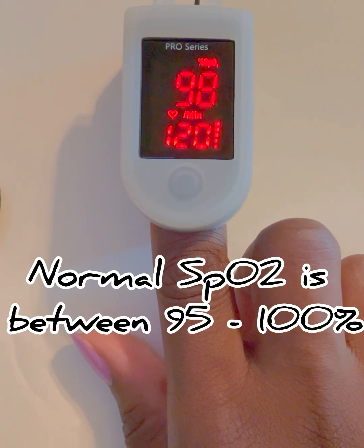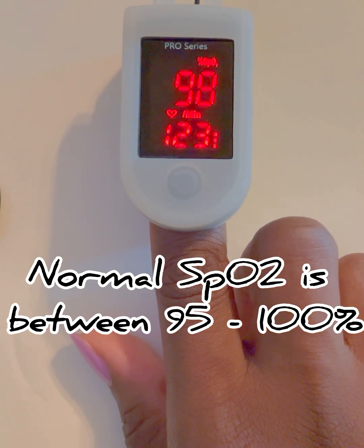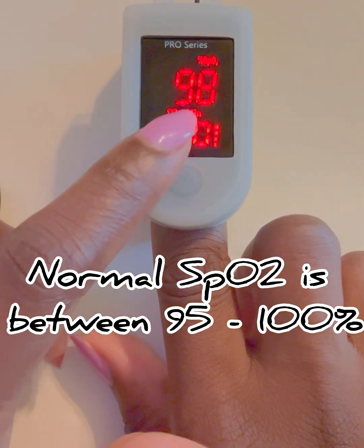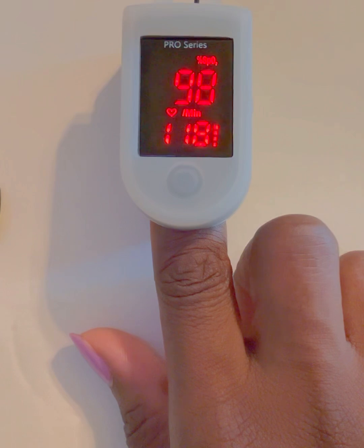Now, how to interpret the levels. A normal SpO2 level is between 95% to 100%. As you can see above, my SpO2 is currently at 98%, which is within the normal range.